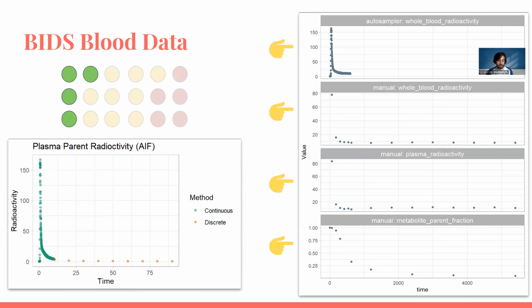And sometimes we'll also fit a line to that too. There are several models for this. Sometimes it's necessary, sometimes it's not, sometimes it's preferable, sometimes it's not. All of these modeling decisions are up to you. The important thing that I wanted to get across, though, is that you typically do not have direct measurements of the arterial input function.